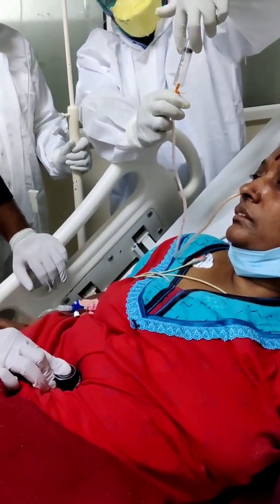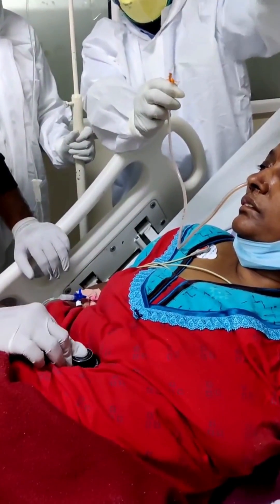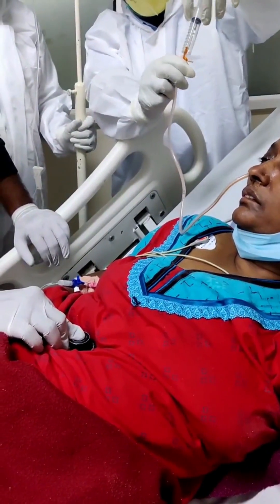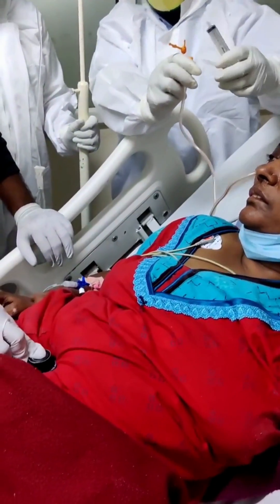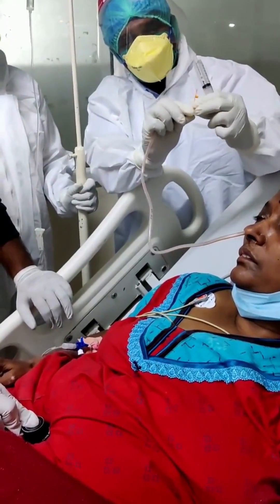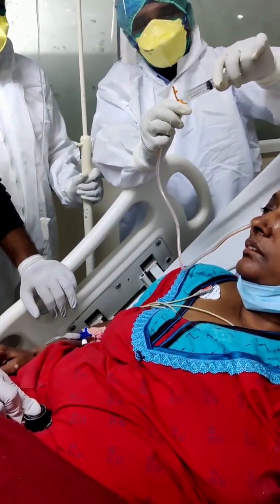The correct intragastric position is then verified. The tube is fixed to the nose and forehead using adhesive tapes. The stomach is decompressed by attaching a 60 milliliter syringe and aspirating its contents. Blocked tubes can be flushed open with saline or air.